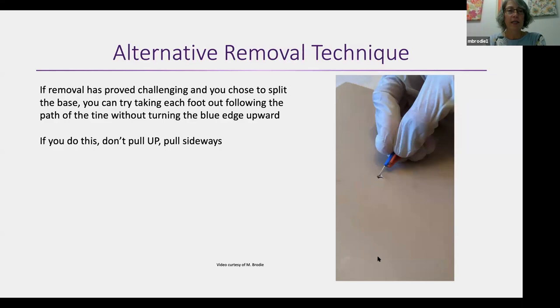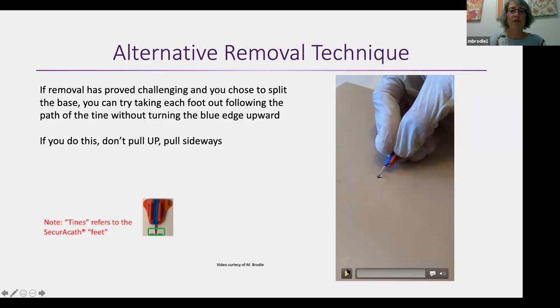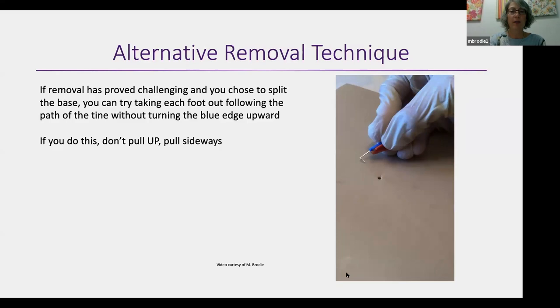sometimes on the ones that are really stubborn, I have found it a little bit easier. Instead of twisting the blue to the sky, even with the split method and pulling up, on the ones that are particularly stubborn, I have a side motion where I just pull it out sideways, following the track of the tine under the skin. So if we run this video, you'll see in slow motion what I'm talking about. So you're pulling it out sideways.